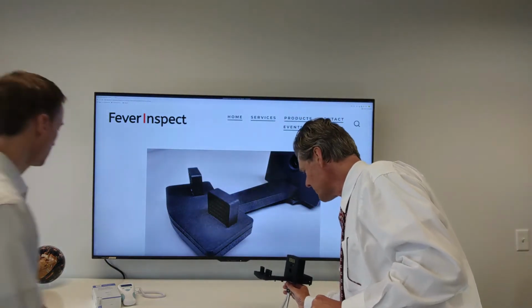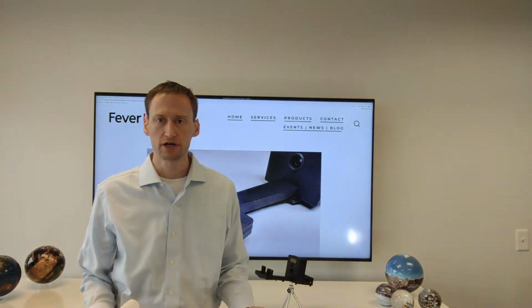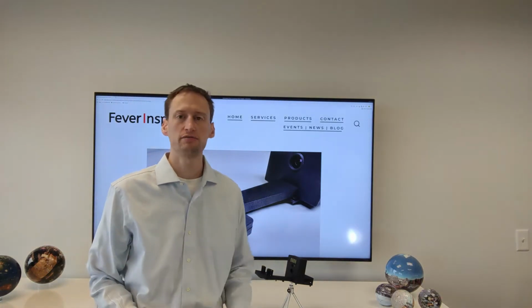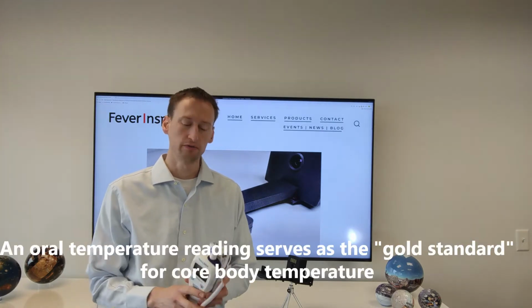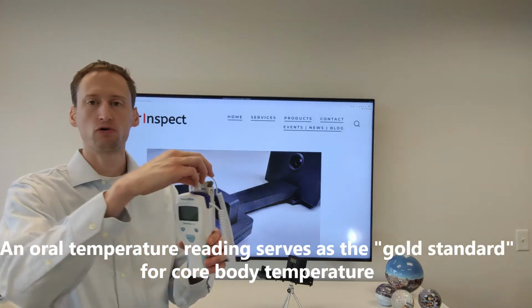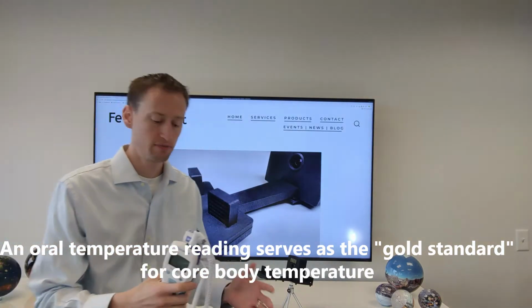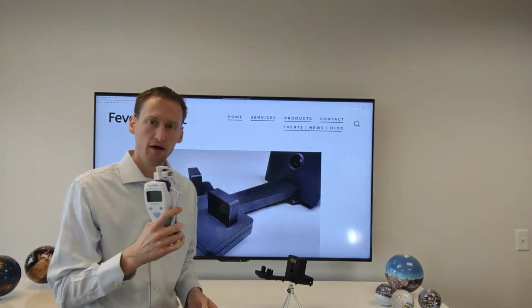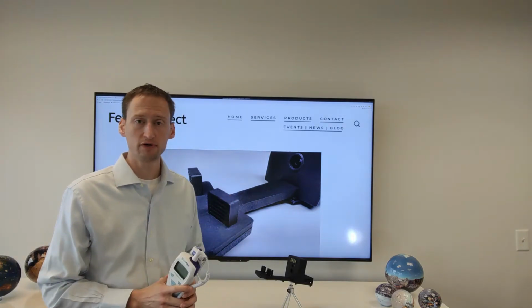Eric? Thank you, Brad. So if you can imagine a school, 75 degrees out, you set up one of these systems, of any non-contact infrared measurement system, and you set the threshold. Perhaps you even got a nice clinical oral thermometer with a heated probe, one of the proper ones that doctors use at the beginning of every vital signs visit. This will be accurate, and so can the system if you set it up in that 75-degree environment.